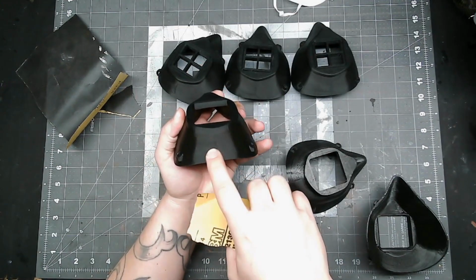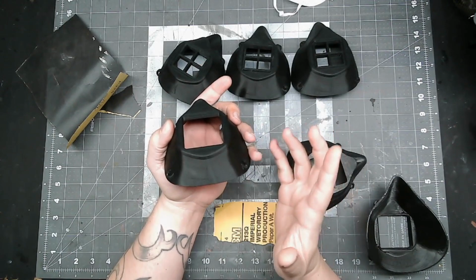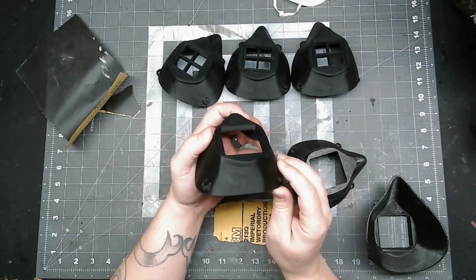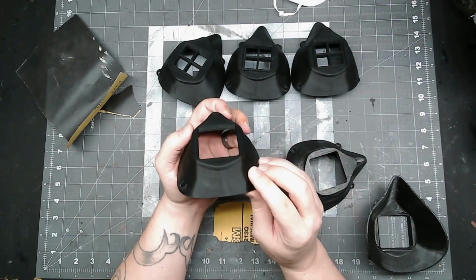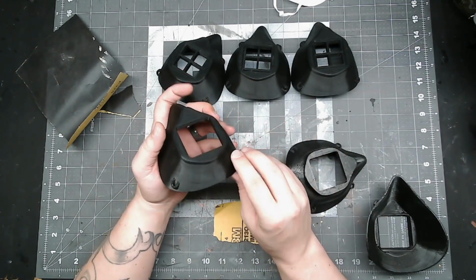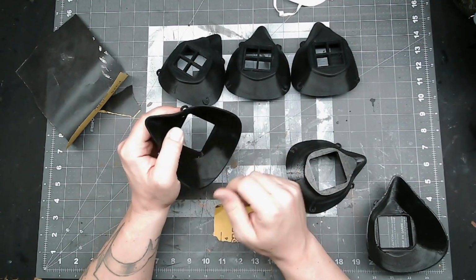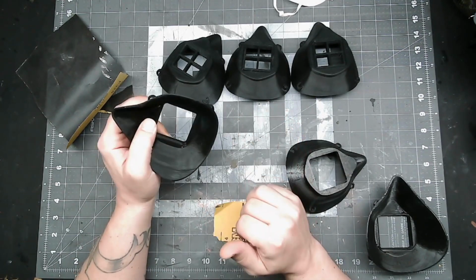It's just a cosmetic fault. It doesn't affect the mask at all. That's just a quirk of the way the file was made. If you're good at 3D printing and stuff, you can clean that up yourself in Blender or Maya, whatever it is you use. But if not, print it as is. It'll work just fine. It's just cosmetic. So go ahead and sand anywhere it touches inside the face, along these edges, that kind of stuff.